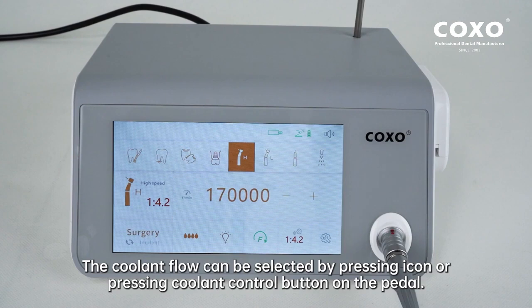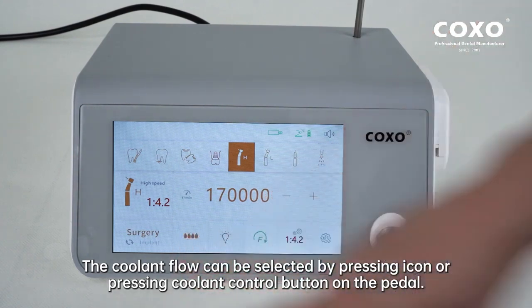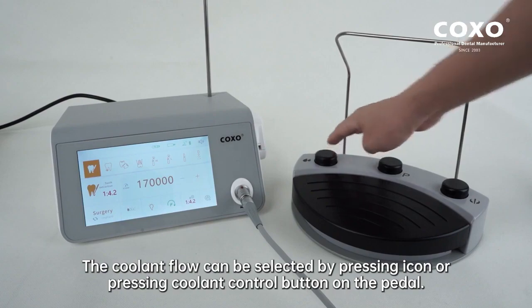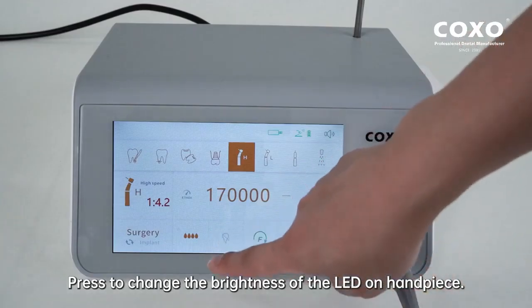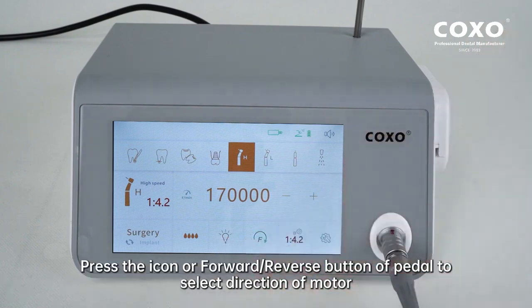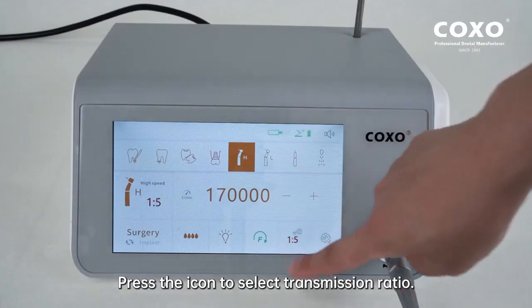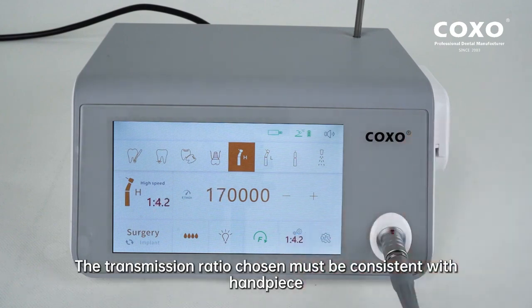The coolant flow can be selected by pressing the icon or pressing the coolant control button on the pedal. Press to change the brightness of the LED on the handpiece. Press the icon or forward/reverse button of the pedal to select the direction of the motor. Press the icon to select the transmission ratio. The transmission ratio chosen must be consistent with the handpiece.